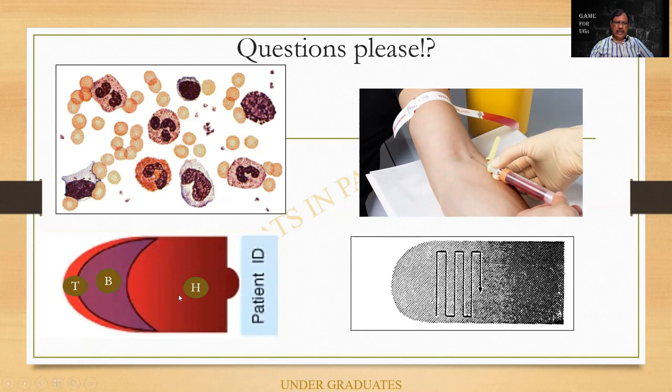Second one is the body, and here it is also fairly dense, but as we go towards the tail, the cells tend to get distributed. They say, in fact, the junction between the body and the tail will be apt for the study of the morphology. And this incidentally indicates a method of counting. We shall be going to it later on.